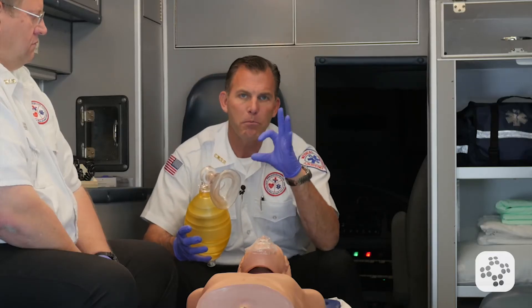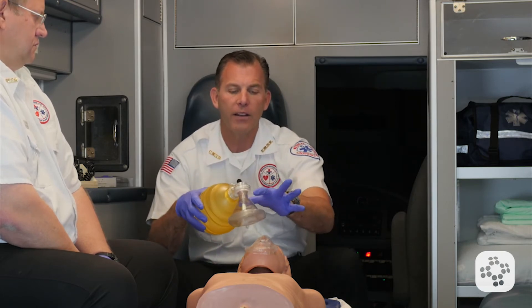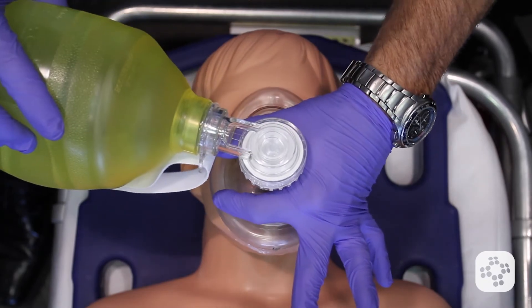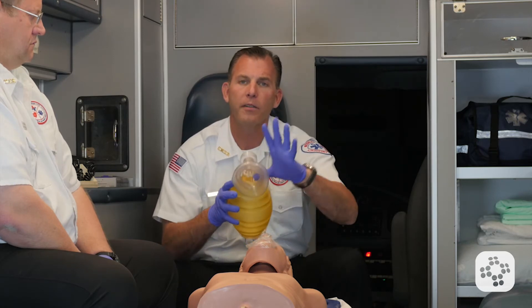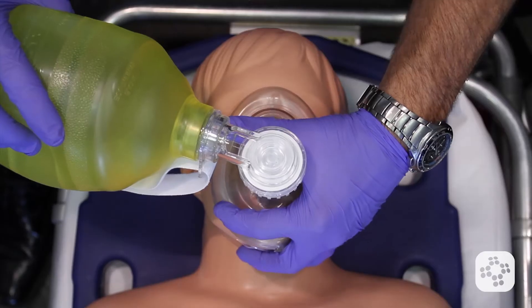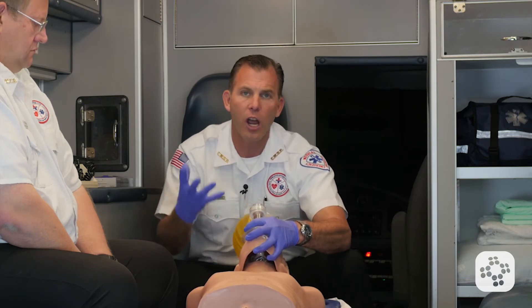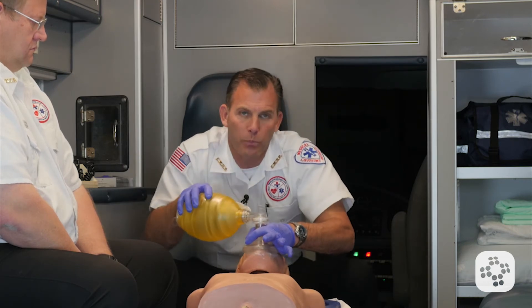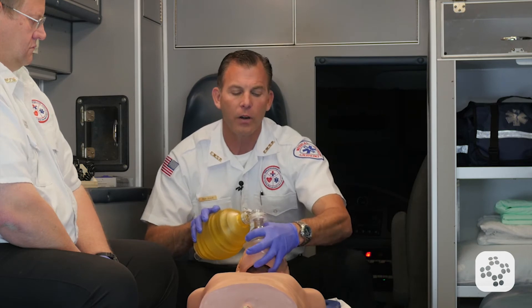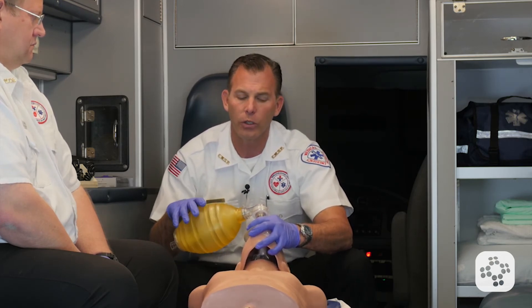We use a specific method called the CE method for holding and sealing the mask. We form a C with the thumb and index finger around the stem of the bag valve — this helps balance pressure on one side of the face. The palm of the hand provides pressure on the other side of the mask. The E portion of the fingers grabs the mandible or jawline and draws the jaw up into the mask. A common mistake is pushing the mask down over the face; instead, we seal with fingers and palm while pulling the jaw up into the mask to achieve a good seal and deliver a successful rescue breath.